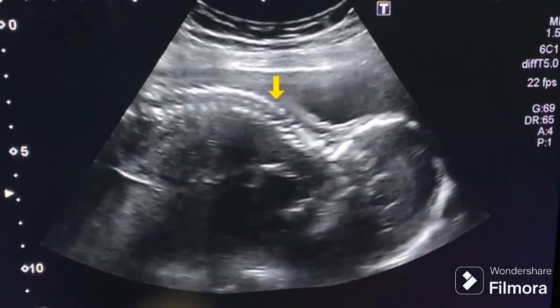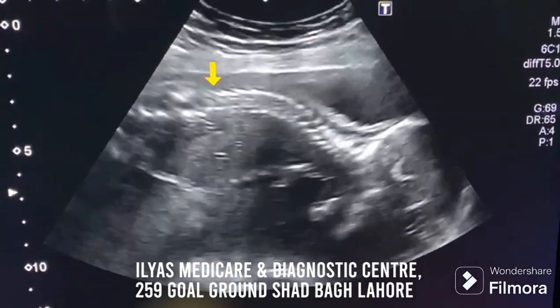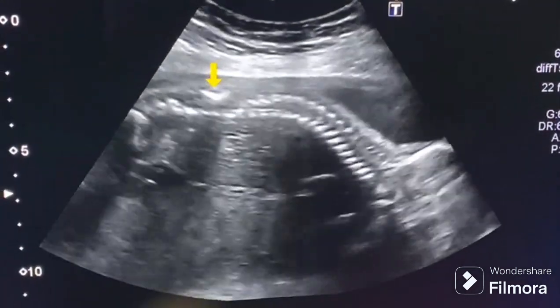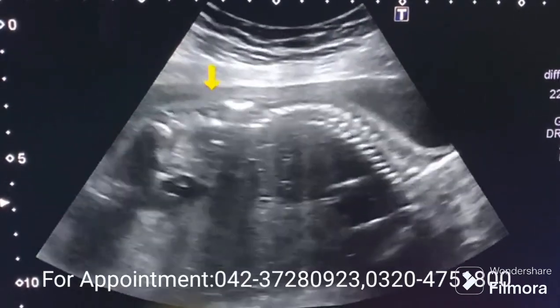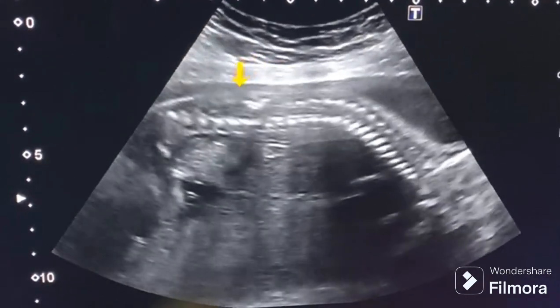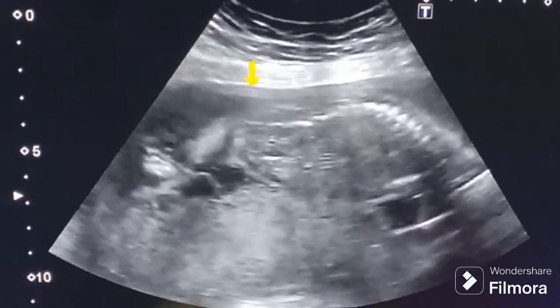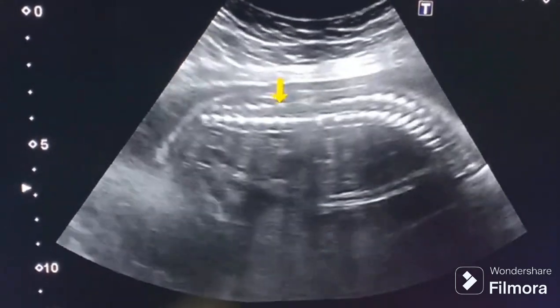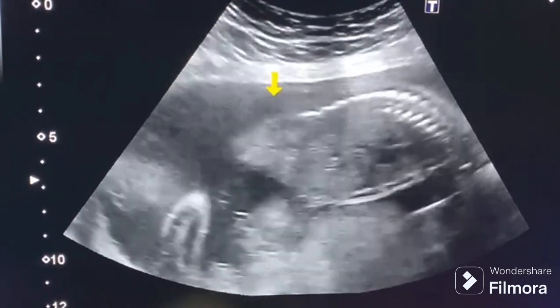Here you can clearly see the spine of the fetus and you can see the double tram track appearance. And this double tram track appearance suddenly disappears at this spot, and here is the posterior osseous defect. Now when we will move, this is the area of the defect and it is covered by skin. Now when we will move downward, here you can see the posterior elements are again clearly visible, and so there is a defect in the upper lumbar level.